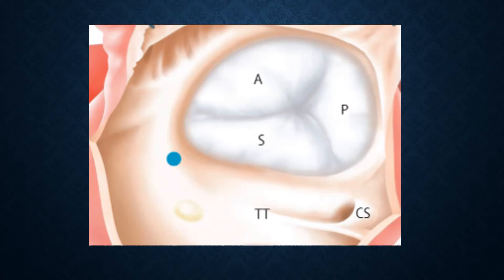Tricuspid valve usually has three leaflets, including anterior, septal, and posterior. Septal leaflet is the longest leaflet, anterior is the largest leaflet, and posterior is the smallest leaflet.